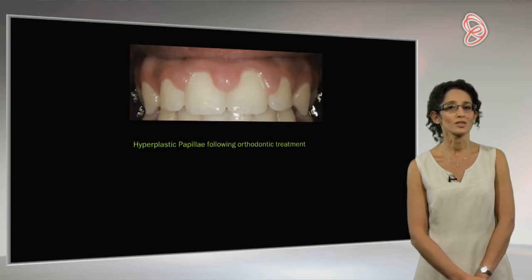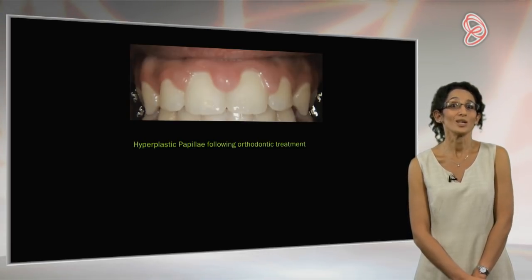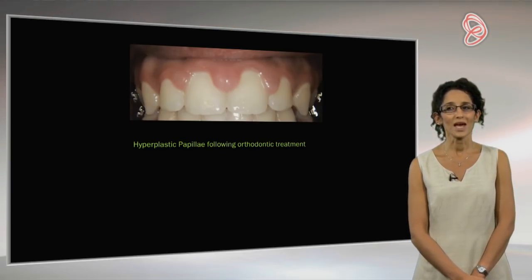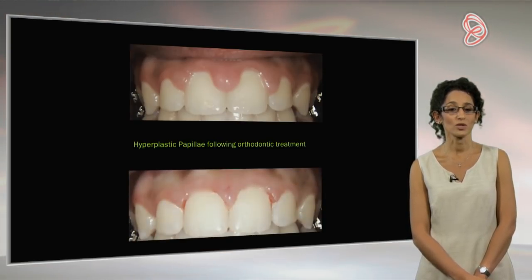So this wasn't just a poor oral hygiene issue while he had orthodontic treatment, but it's to do with the bunching. So again, to start using a scalpel blade on this and try to reshape this and define it would be quite a challenge. Again, young patient, nervous, doesn't like needles. So we've been able to really use a lot of very fine precision with the laser just to reshape those papillae. So it's subtle gingivectomies.